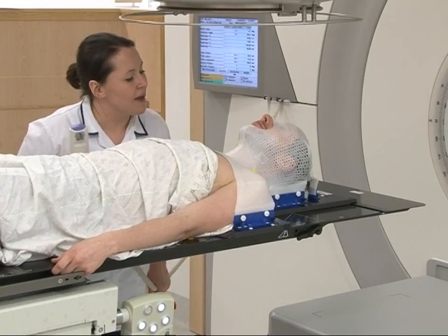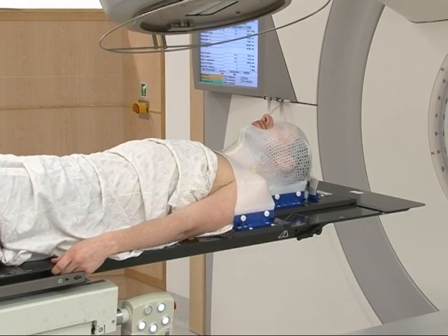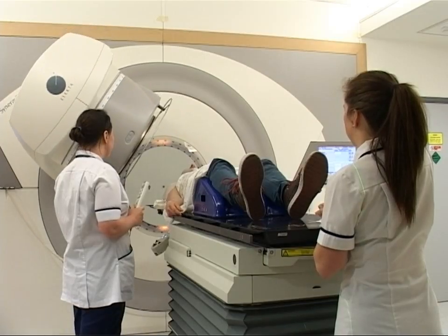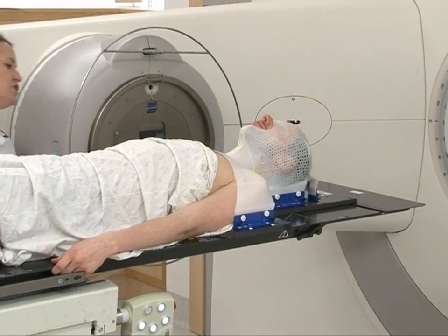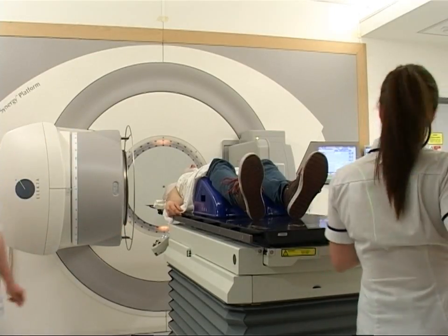As with the planning scan, the radiographers will be in the treatment room with you while they position you for treatment. The room lights may need to be dimmed to help position you. They will only leave the room for a couple of minutes whilst the machine is switched on, and are watching you all the time through CCTV cameras.